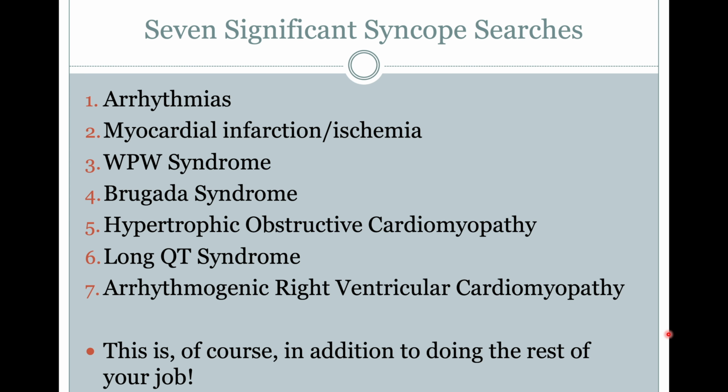If you do find one of these, you end up looking a little bit heroic that you discovered it. So it's a good habit to do on every syncope patient.